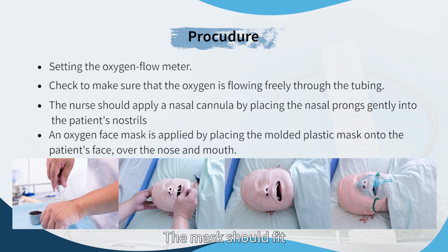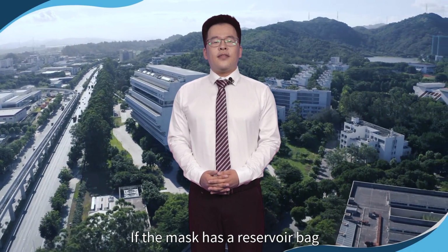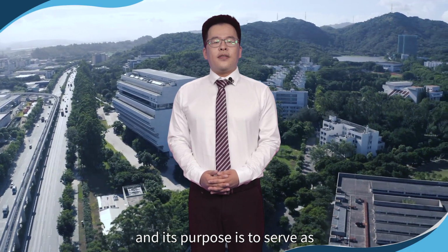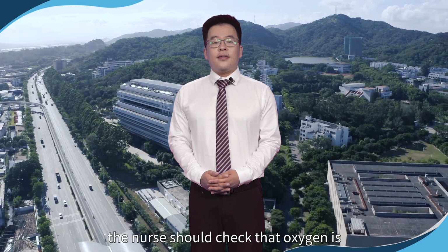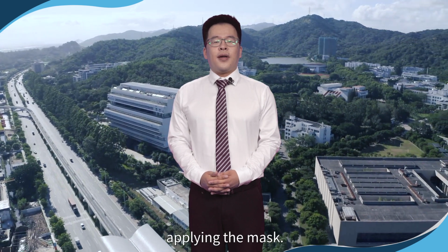The mask should fit snugly against the face, but must not press so tightly as to leave impressions on the skin. If the mask has a reservoir bag and its purpose is to serve as an oxygen reservoir, the nurse should check that the oxygen is filling the bag before applying the mask.